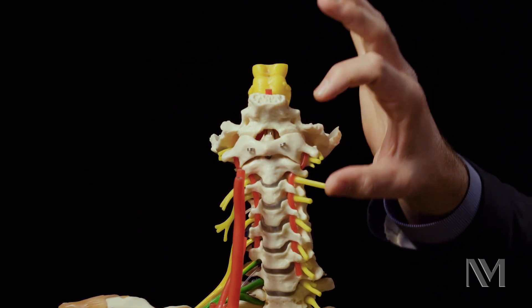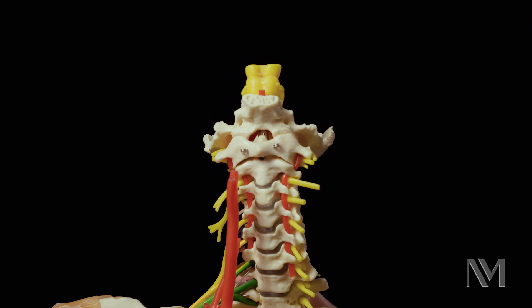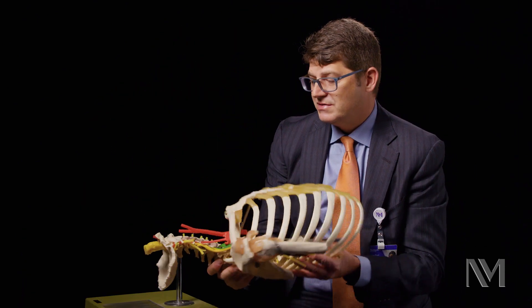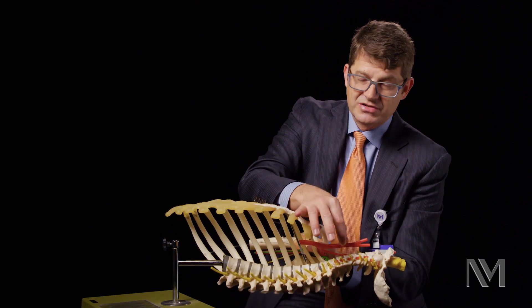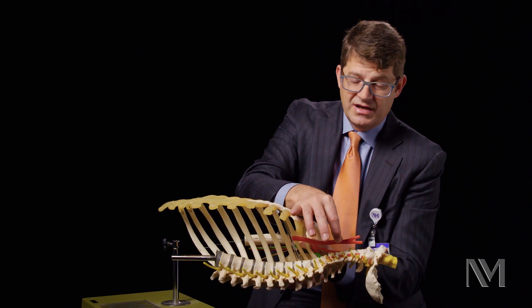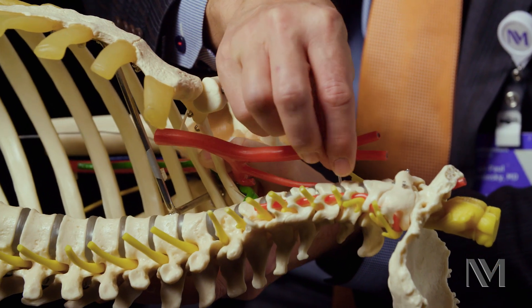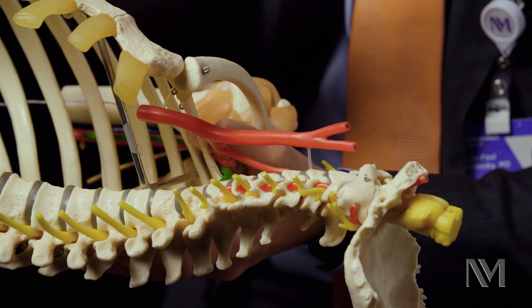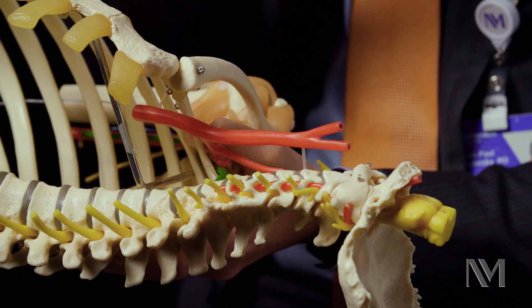In this approach, going through the endoscopic approach, the patient is lying on the operating room table like this. We place a tubular retractor coming through an anterior cervical discectomy approach at essentially the C4-5 level, angling up to the base of C2. When we're looking down that tubular retractor, we're seeing that C2-3 disc space.